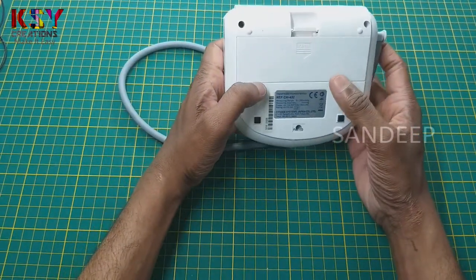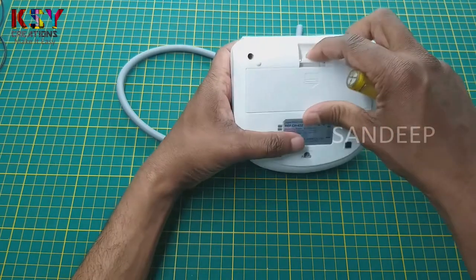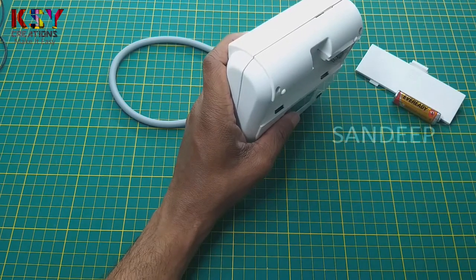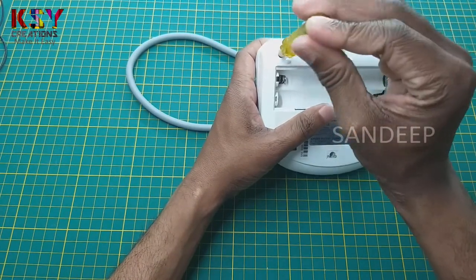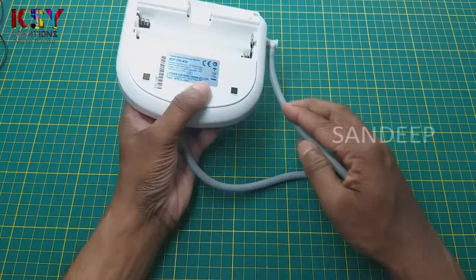There are 3 screws on this. I will remove the screws. I have removed all 3 screws.